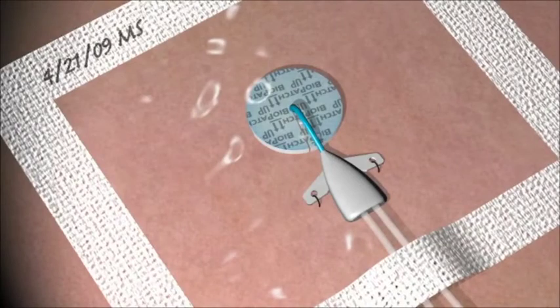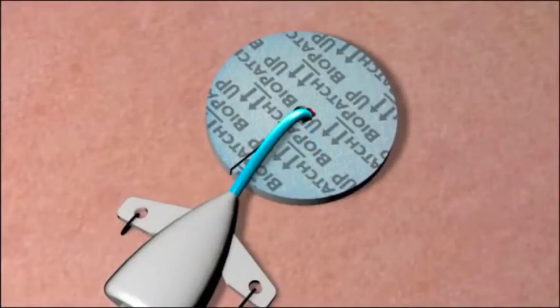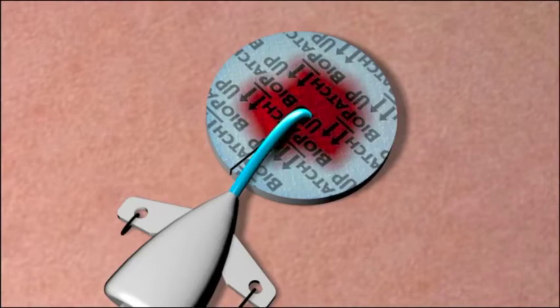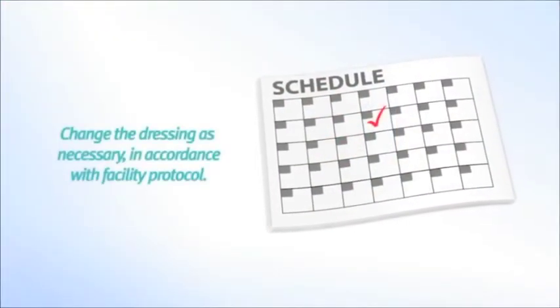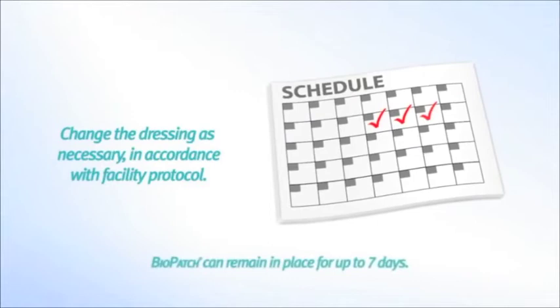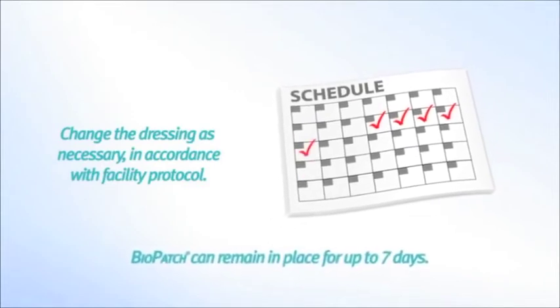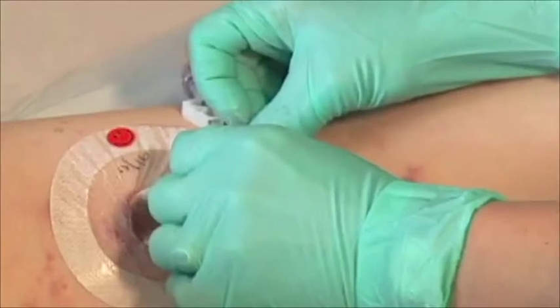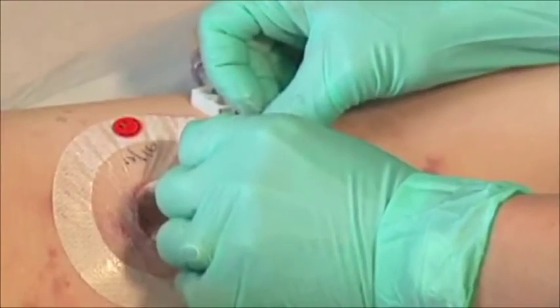Secure the catheter and BioPatch to the skin with a transparent dressing and date it consistent with hospital protocol. BioPatch will absorb up to eight times its weight in fluid and remains effective in the presence of blood and wound fluid. Dressing changes should occur at least every seven days, however dressing changes may be needed more frequently with highly exuding wounds.